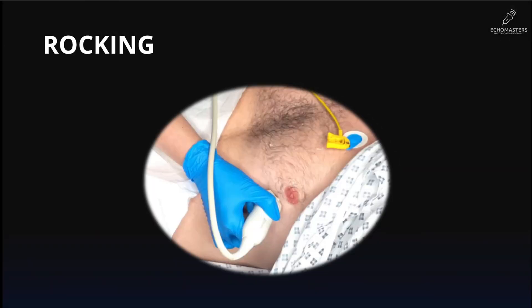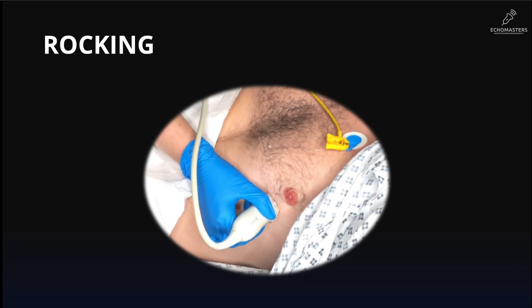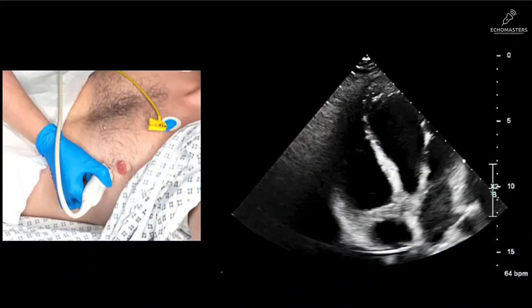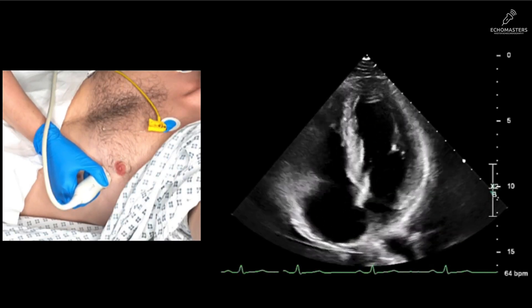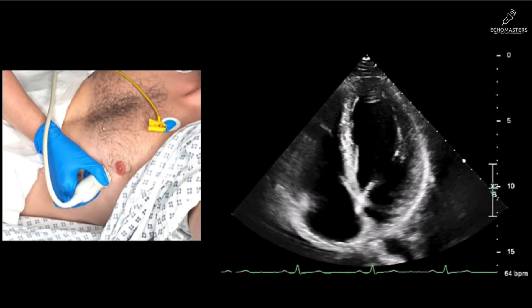Our third movement is rocking. If tilting is aiming up and down, rocking is aiming side to side. Again, the probe's footprint stays in one place on the skin, but we gently rock the probe along its long axis to steer the beam left or right, medial or lateral. This is a critical skill for fine-tuning. For the apical four-chamber view, we use this subtle rocking to optimize the view by aligning the interventricular septum vertically and centralizing the LV apex.